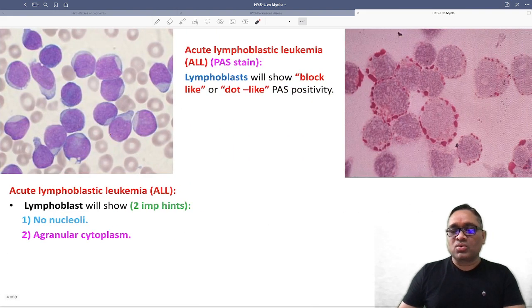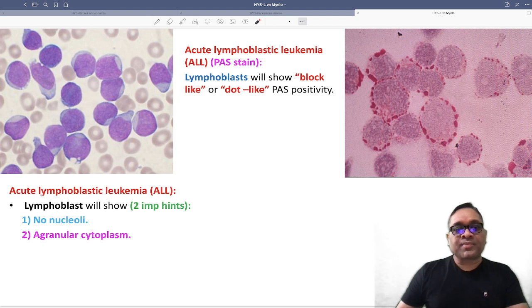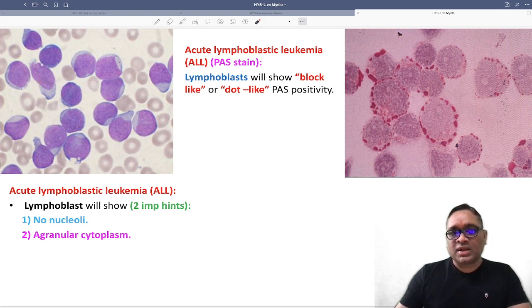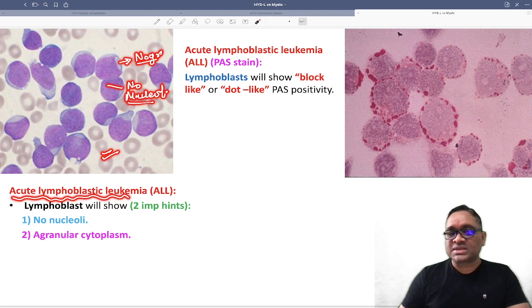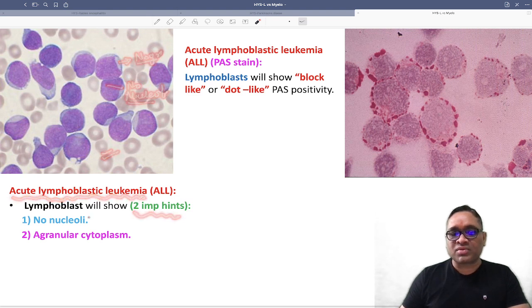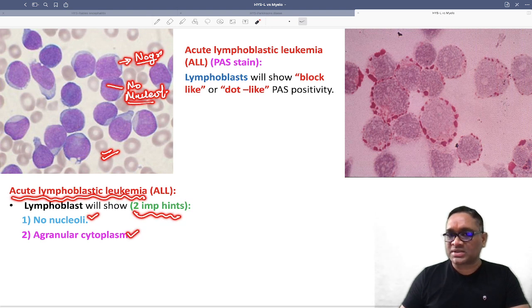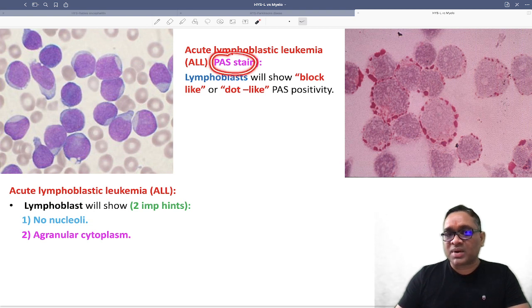Now let us look at the peripheral smear or aspirate. In ALL, you can see all these cells are visible — none of the cytoplasm is having granules, so there is no granule in the cytoplasm, and you cannot see any nucleoli either. No granules, no nucleoli — this is the lymphoblastic cell, so acute lymphoblastic leukemia.